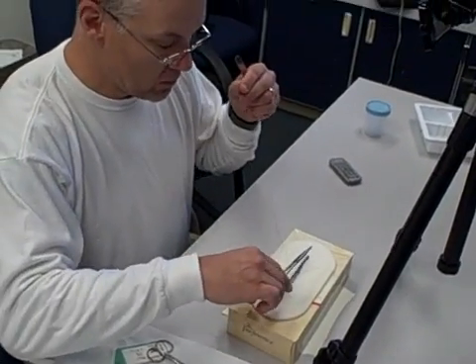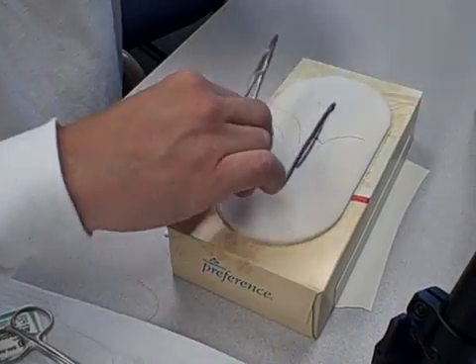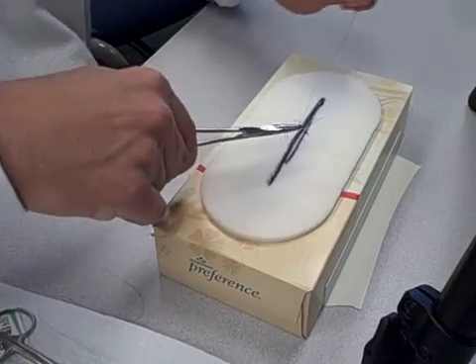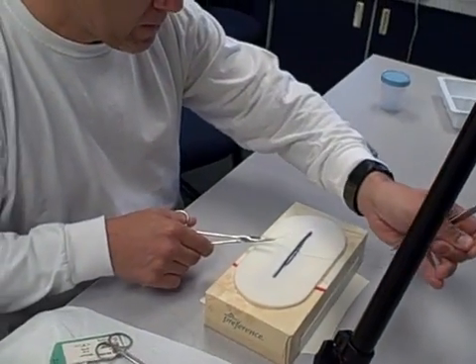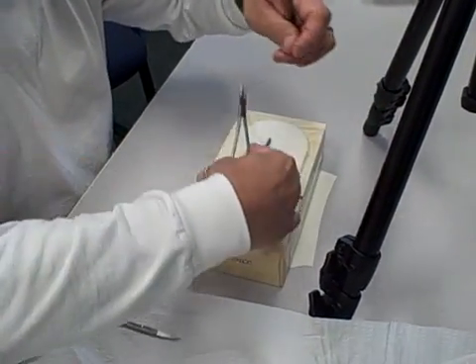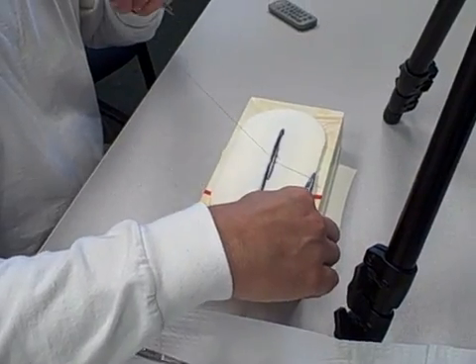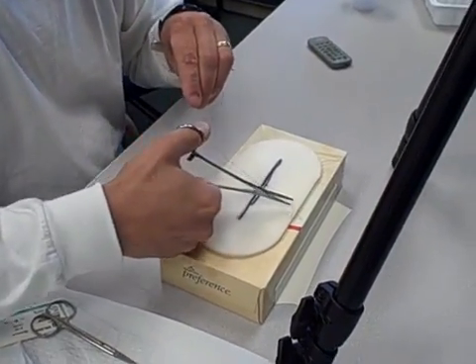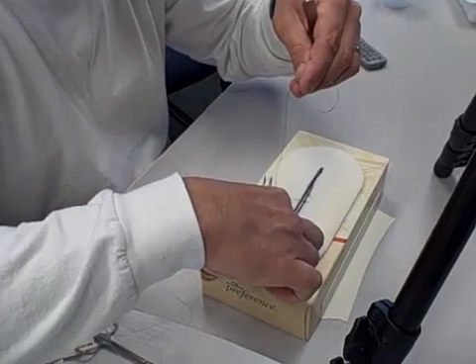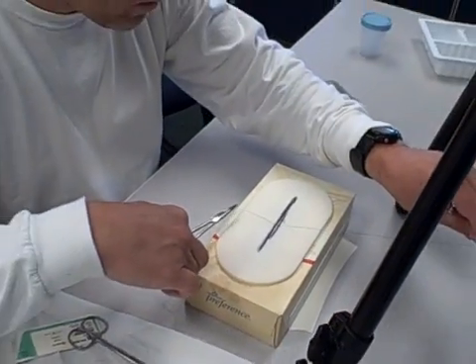So now you've got your short and your long. The one thing that Tony's doing that's very important — that a lot of beginning people don't do — is he's got his hands far away from the wound. Beginning people are too close to the wound and it makes it very difficult to manage the material. That's excellent technique. You notice he's going long over the driver towards the short, picking up the tail and pulling that suture tight. And his hands are spread apart.